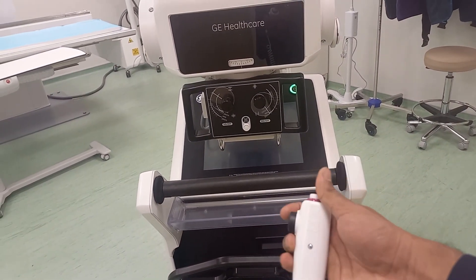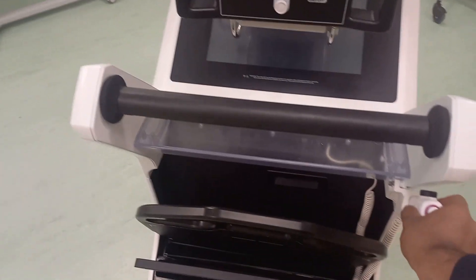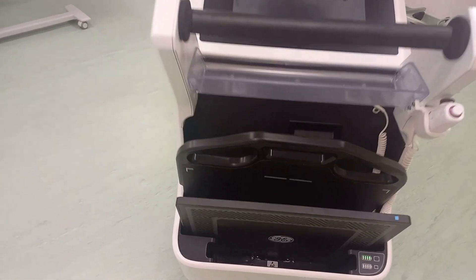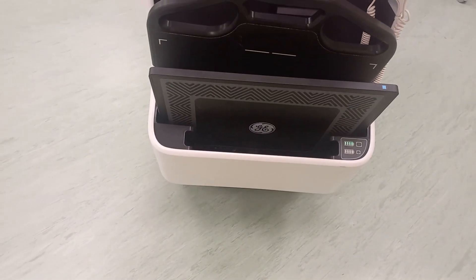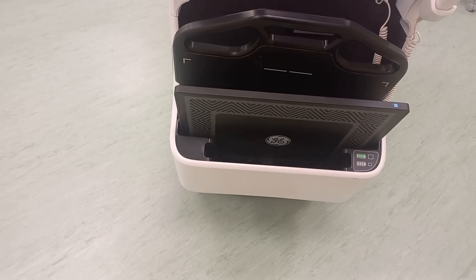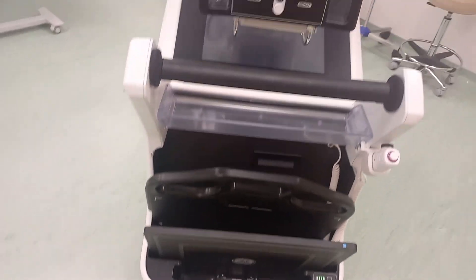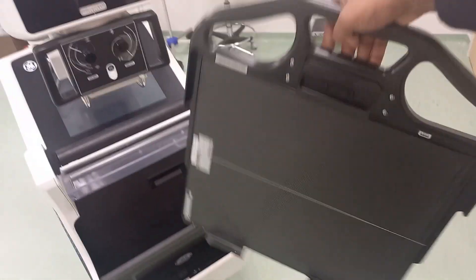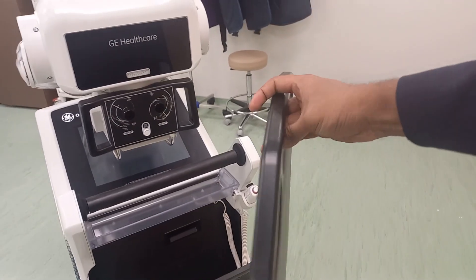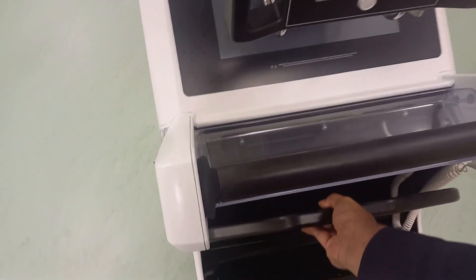You have prep, expose, and collimation light controls. Over here you have the detector charging bin — it can hold up to two detectors: one 14 by 17 inches and a second one 10 by 12 inches. This is the detachable grid along with the handle, and there's a compartment for that, which is pretty cool.